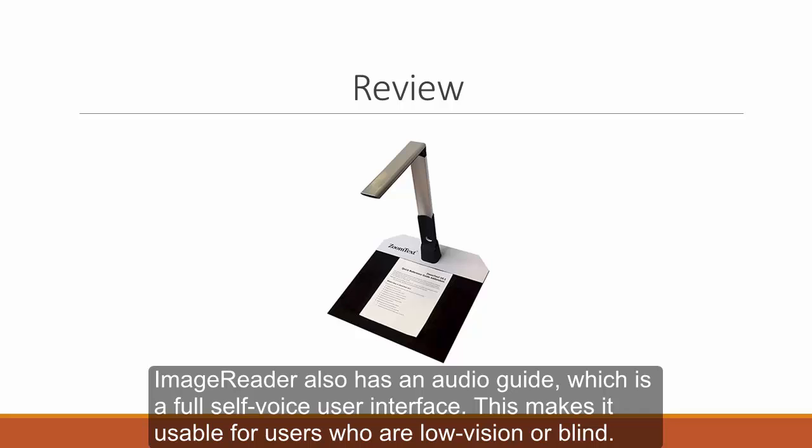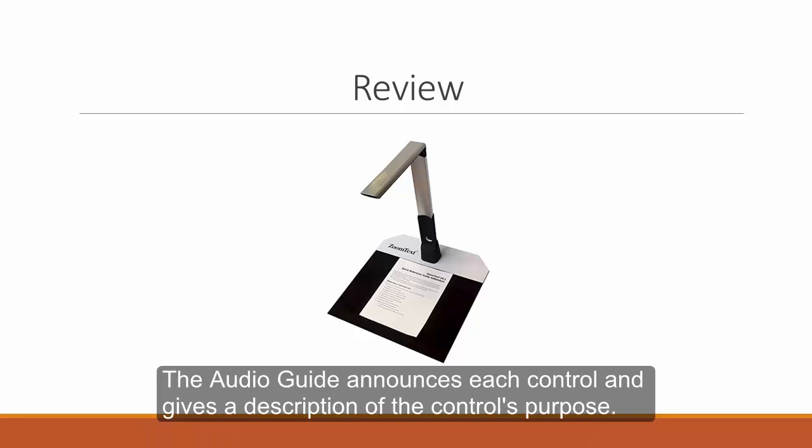ImageReader also has an audio guide, which is a full self-voice user interface. This makes it usable for users who are low vision or blind. The audio guide announces each control and gives a description of the control's purpose.